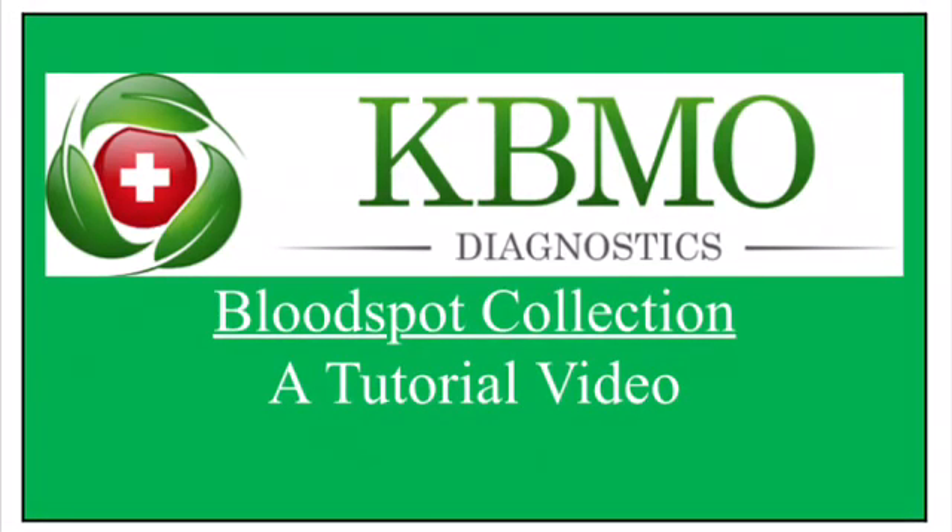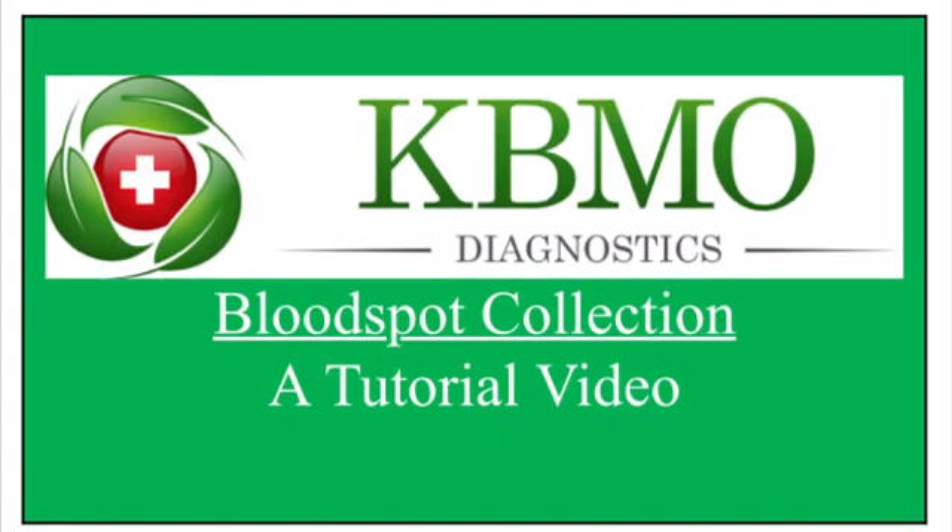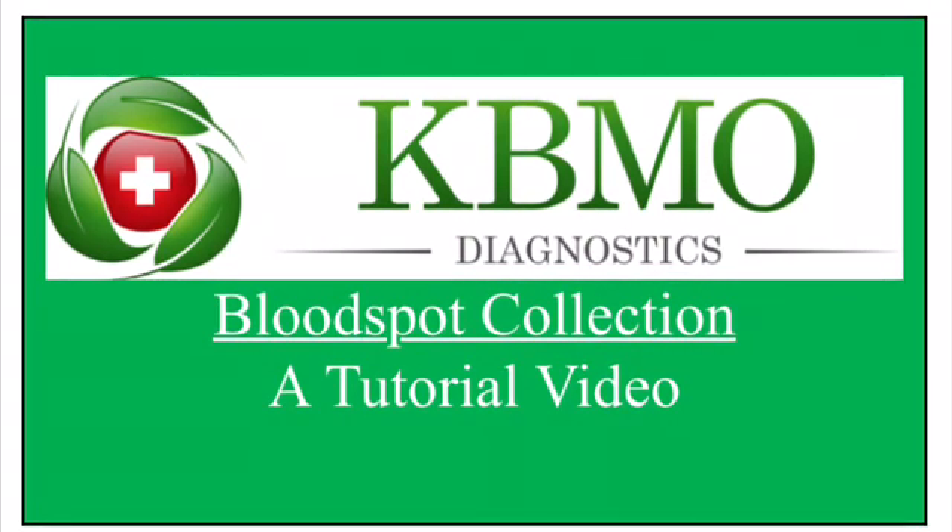In this tutorial video, we are going to demonstrate the proper collection of a finger stick sample for the fit.